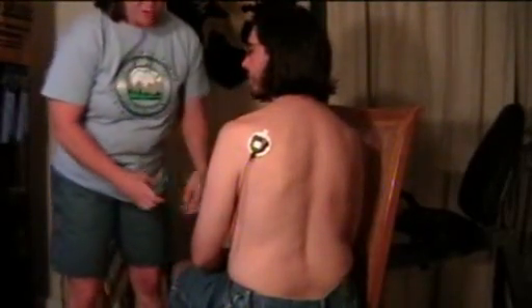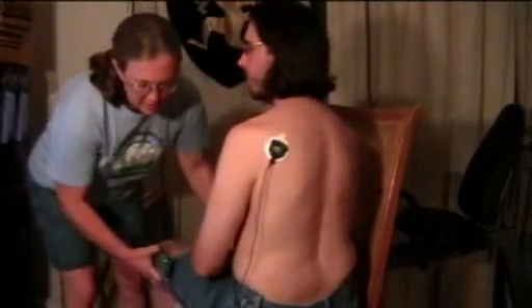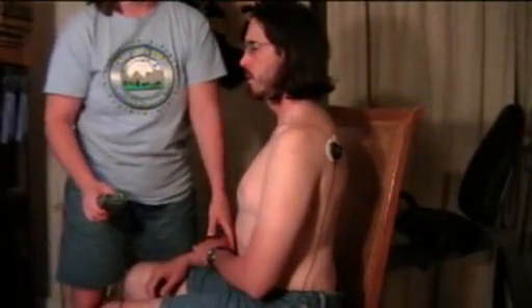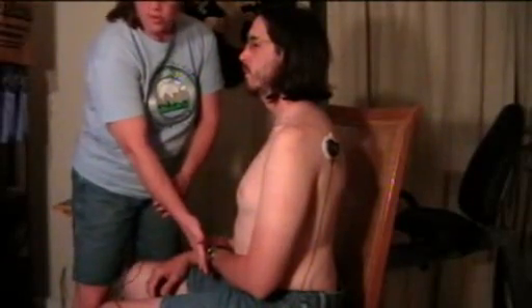And then what you want to do — turn a little bit more so the person can see your arm action. Your arm is going to be across your tummy like that, and it's going to be really hard to open it out to the side. So I think at first, what we want to do is put some resistance right here. We'll have some resistance right here, and you just try and move your arm away against it. And that should give you some movement.